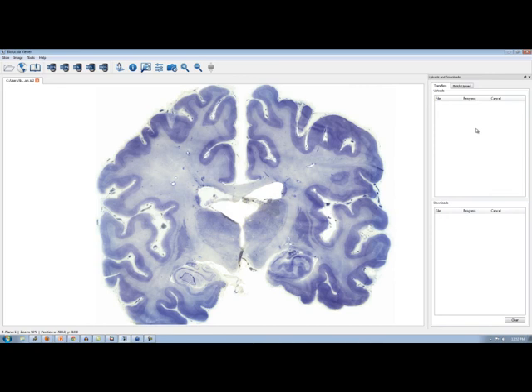Sure. Now, I just mentioned two methods for uploading to the server. There's one more that we're not going to demonstrate, but I just like to talk about it so you know it exists. It's an additional method using something which we call track directories. Now you can set up a track directory in the cloud itself such that any image which gets added to that directory is automatically detected and added into the system. I see. Images can be added that way. Any method that you see fit, standard networking approaches, the images will be discovered in the directory and then automatically added in.